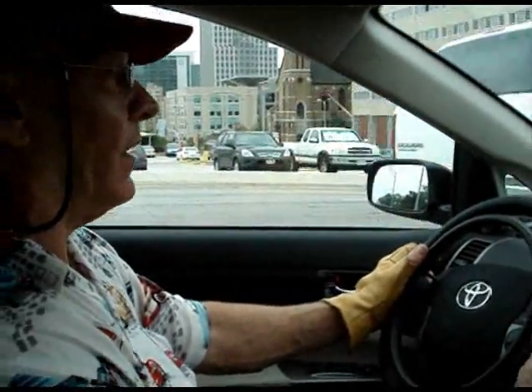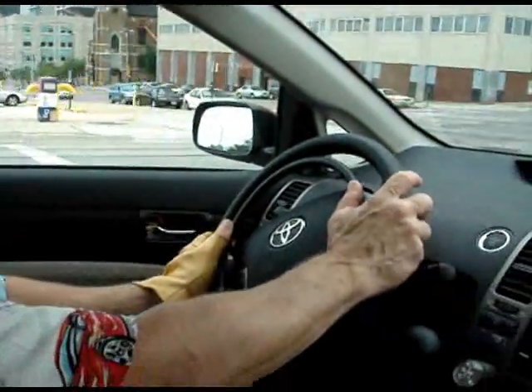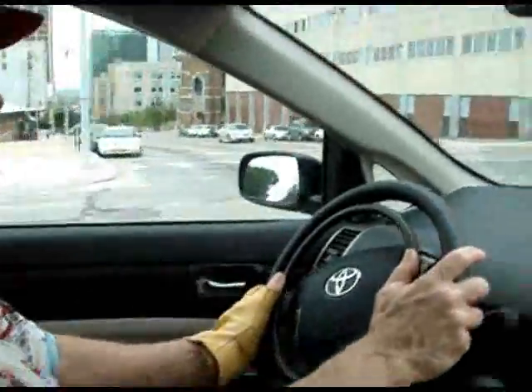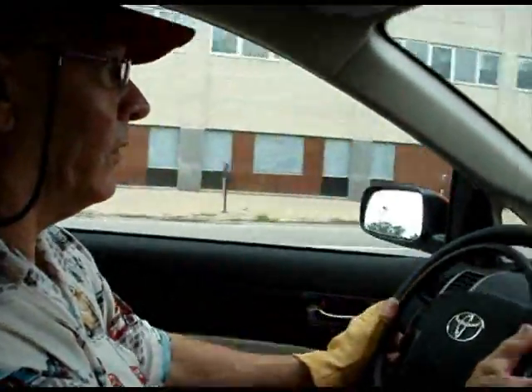The largest movement that I have to make is maybe three inches to the brake, and that's all. I don't have to make any more movements off the steering wheel. And that's really important, because I can maintain two hands on the wheel at all times.